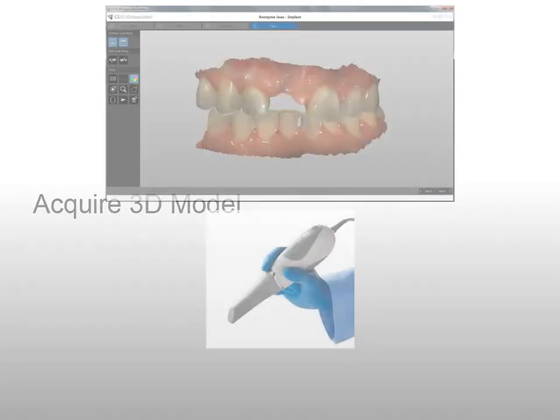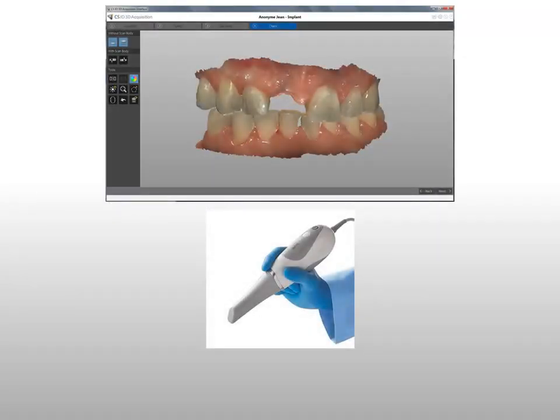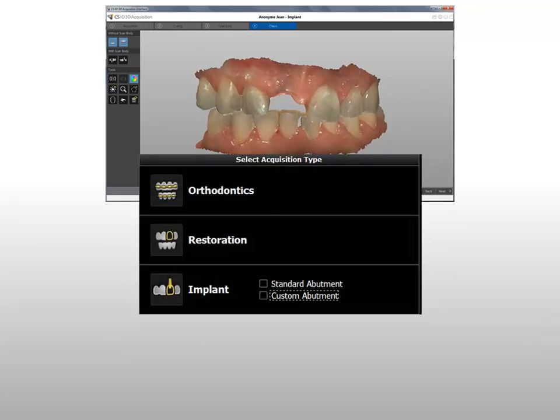Acquire a patient 3D model. You can acquire a 3D model by taking an intraoral digital impression using a CareStream CS3500 or CS3600 intraoral scanner. Orthodontic, restoration, or implant acquisition modes can be used to acquire the digital impression for a prosthetic-driven implant planning analysis.